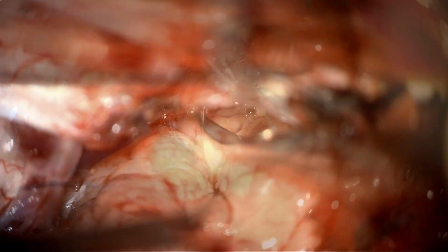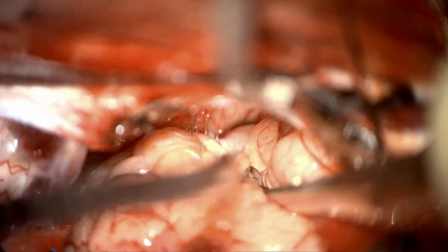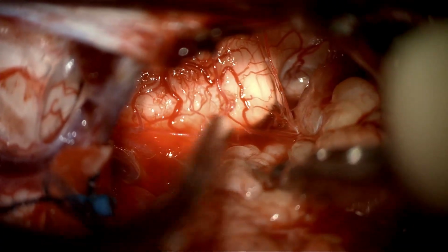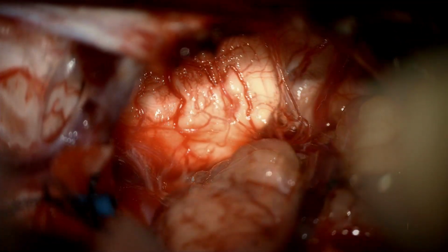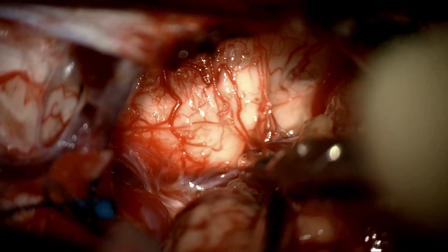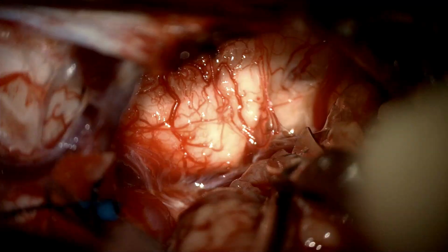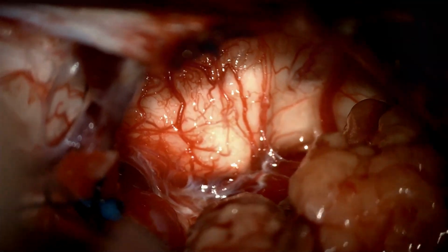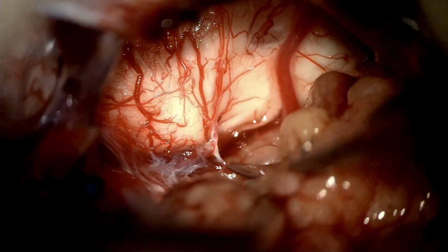Preserving the arachnoid is key to maintain all the vasculature from the tectum and the contralateral occipital lobe. I use my suction as countertraction, and here I'm seeing the contralateral occipital vein.